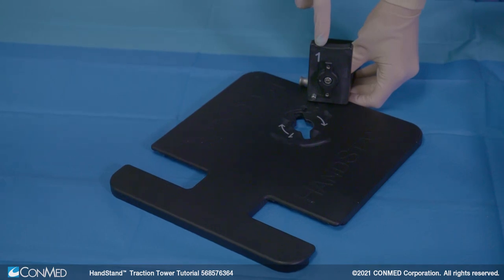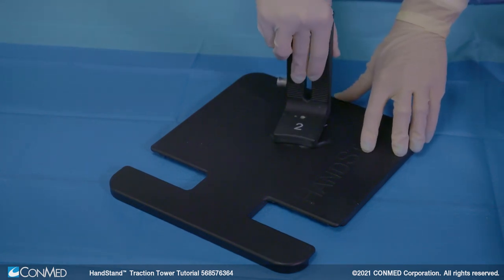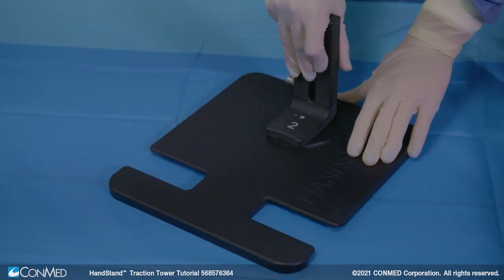First, lock the lower tower into the base plate by inserting the key on the bottom of the lower tower into the key slot on the base plate. Rotate until the lower tower sliding pin locks in place.